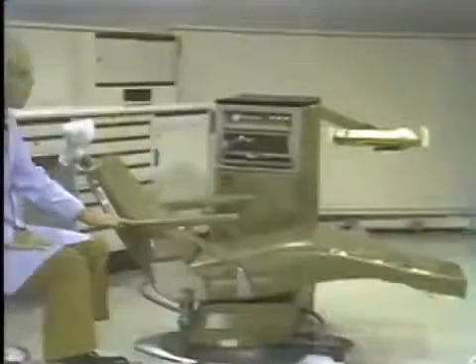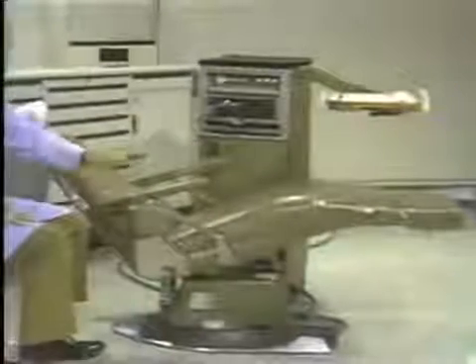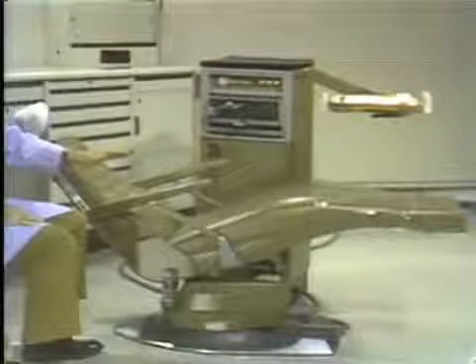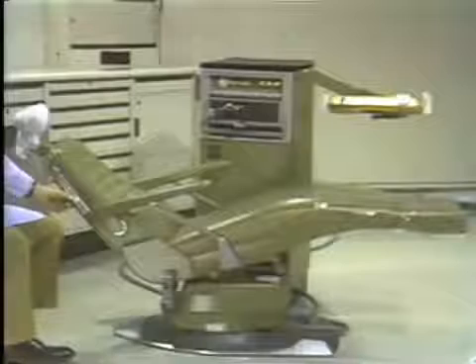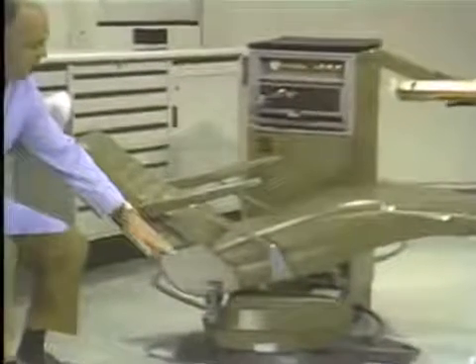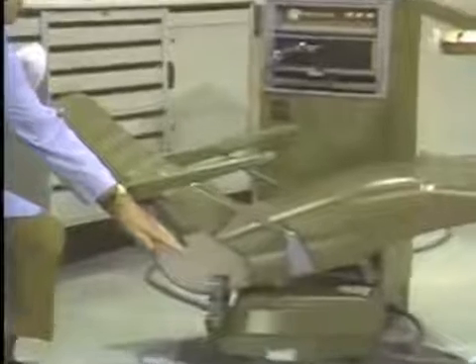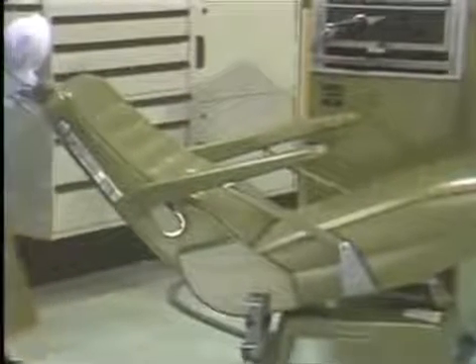The chair is as low to the floor as it will go. The tilt is about 1/2. In other words, the footrest is about parallel to the floor. The back of the chair is back to about the 45-degree mark with the horizontal. This is the basic position for the lower right quadrant.